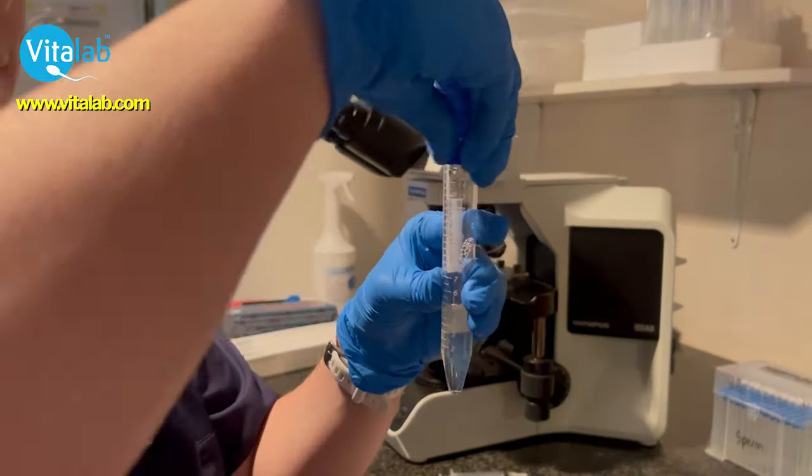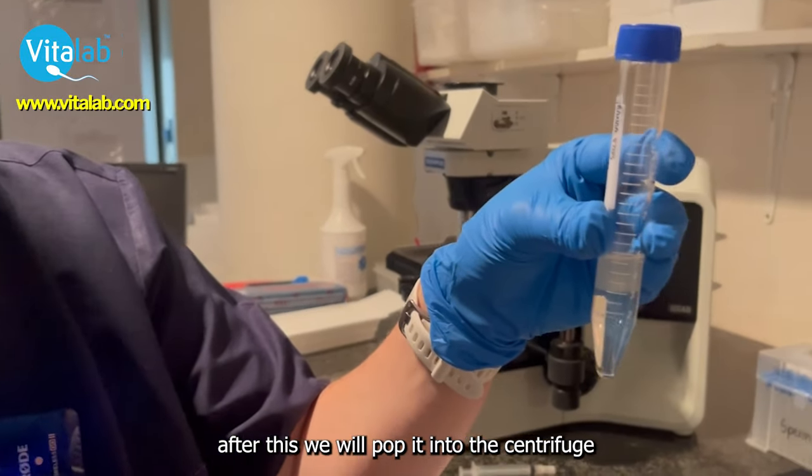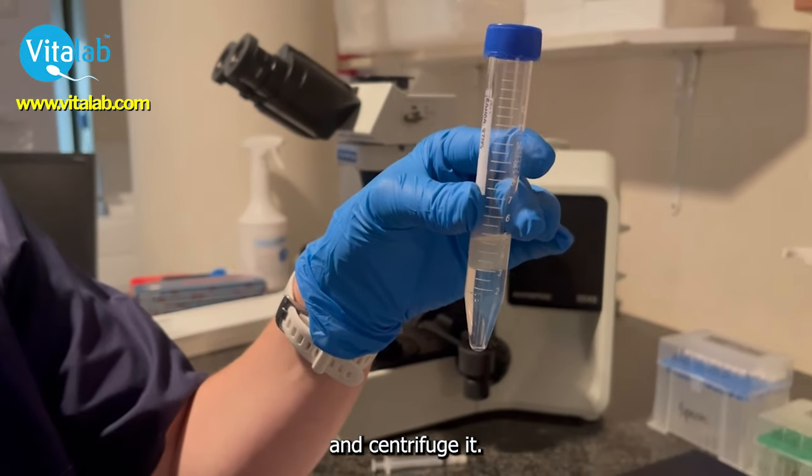The sperm is added. After this, we will pop it into the centrifuge and centrifuge it.